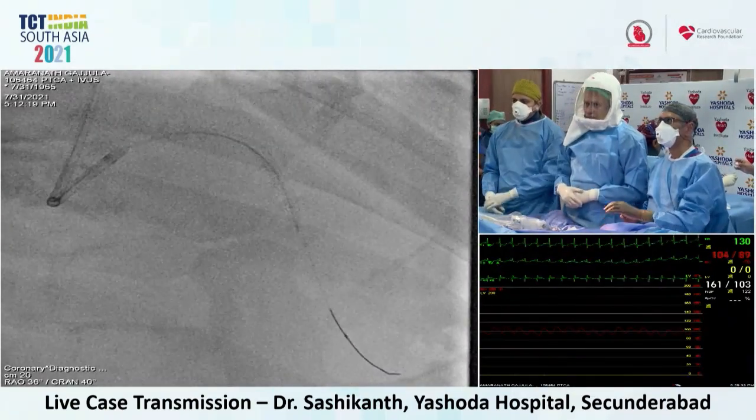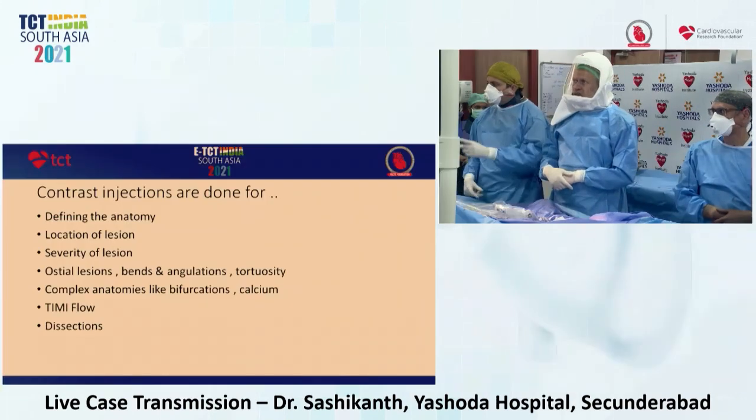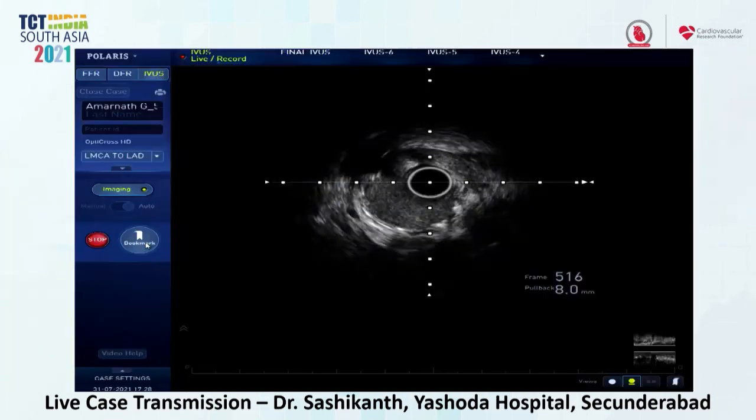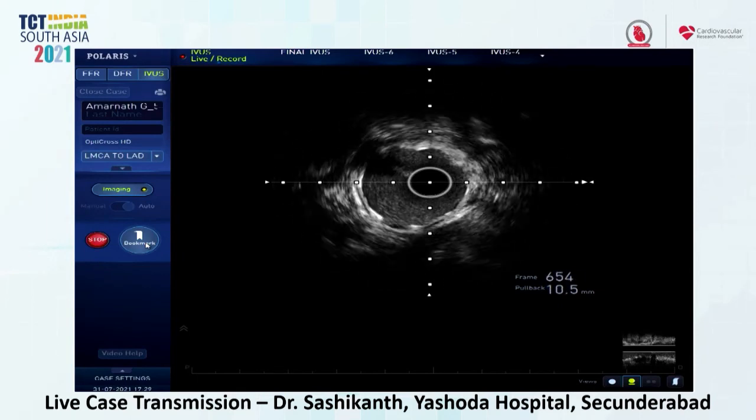Why is his heart rate going up? Can you show the IVUS live? Yes, we are showing the IVUS live. So here is the stent. So the distal stent is well expanded, well apposed.